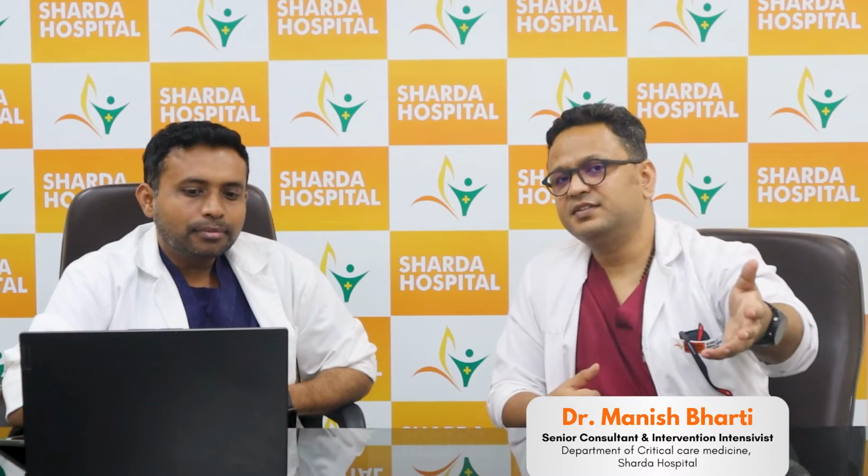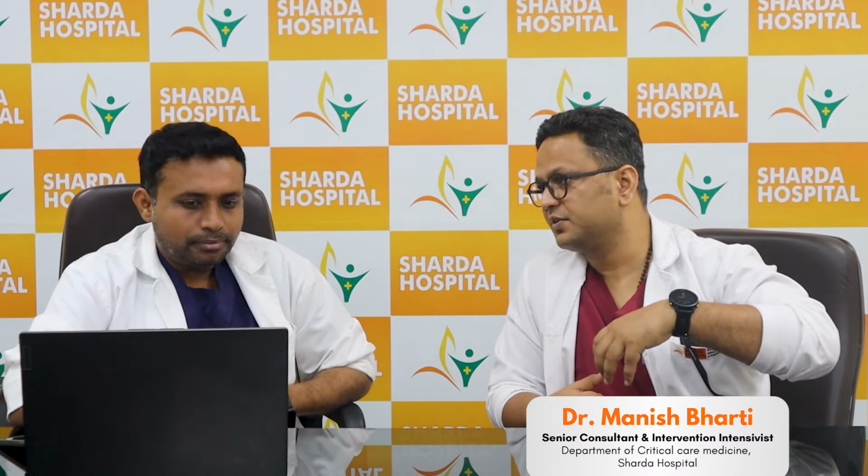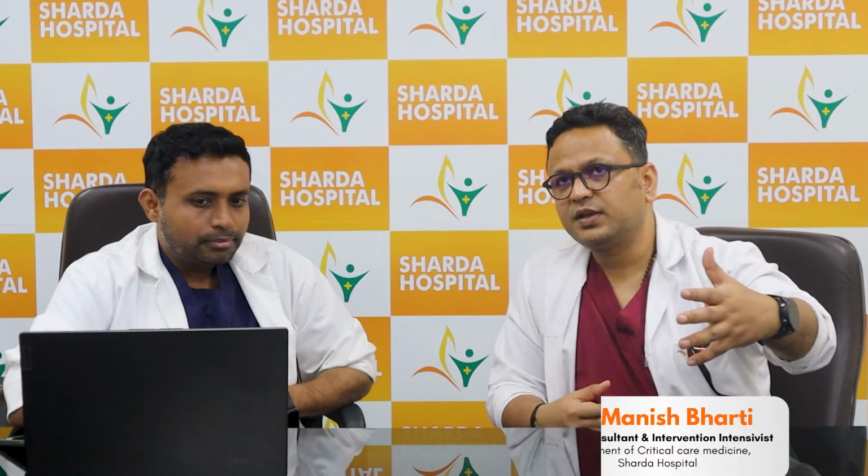Now, what do you mean by diagnostic reason? Let's say a patient is not coming off from the ventilation, and the X-ray is showing some kind of a shadow. We don't know whether this is consolidation or it's related to a mucous plug. You know that every day, every shift, the nurse is also doing suction. So what do you do with the bronchoscopy? It's a sophisticated suction apparatus.